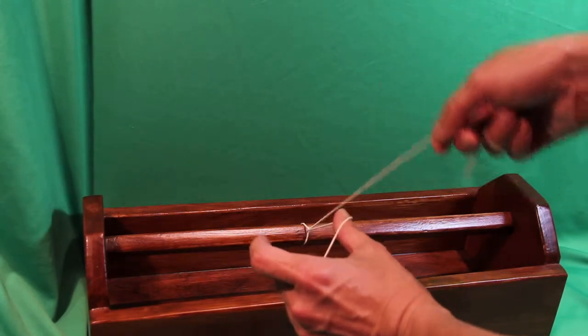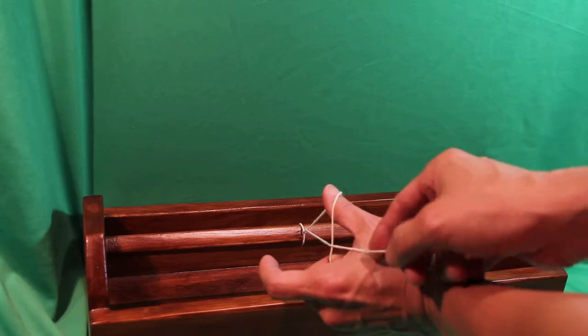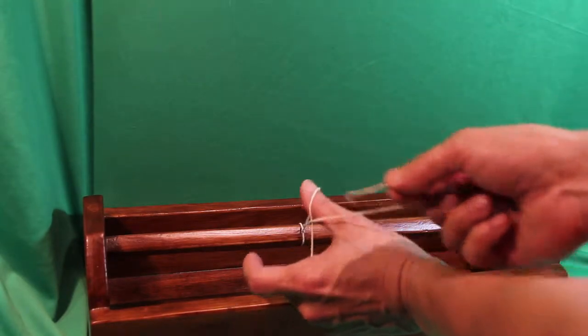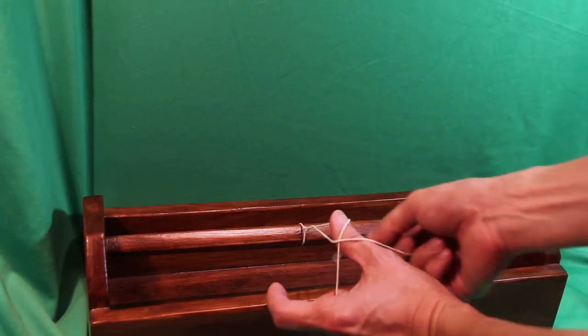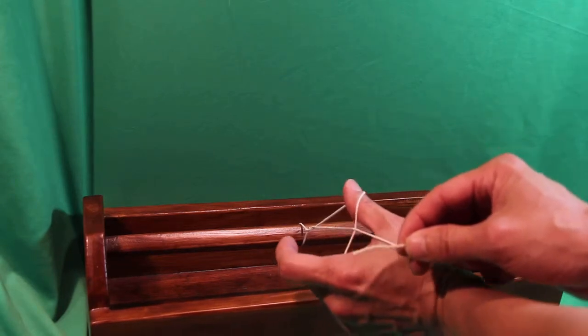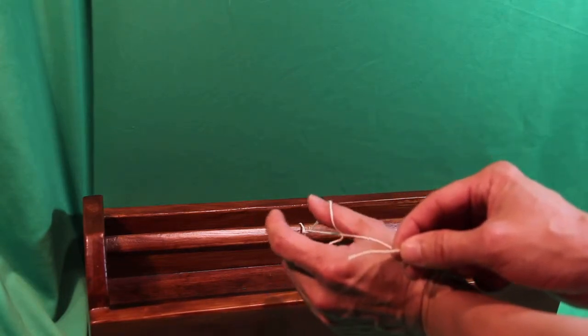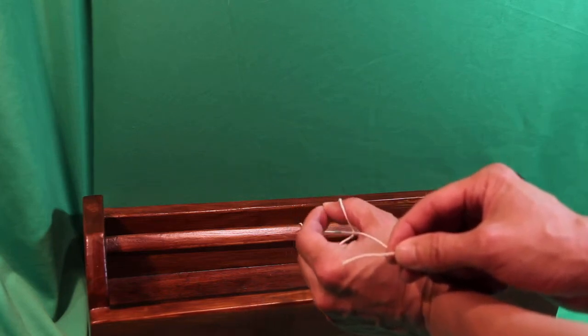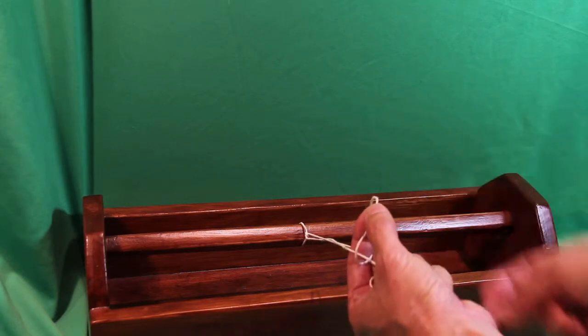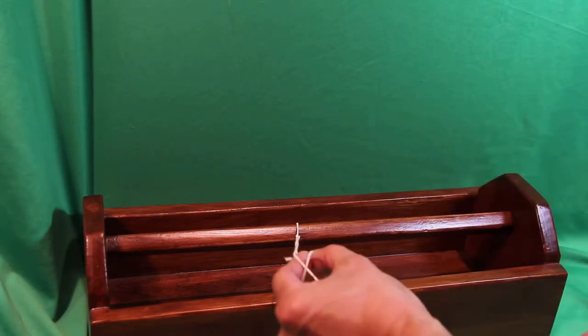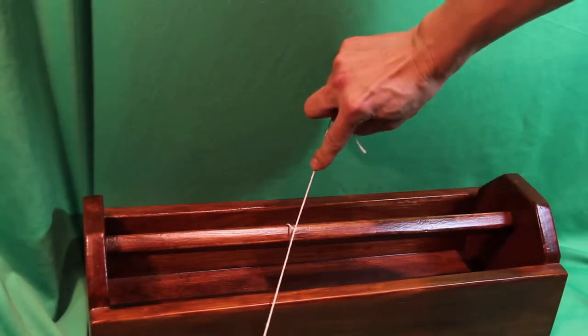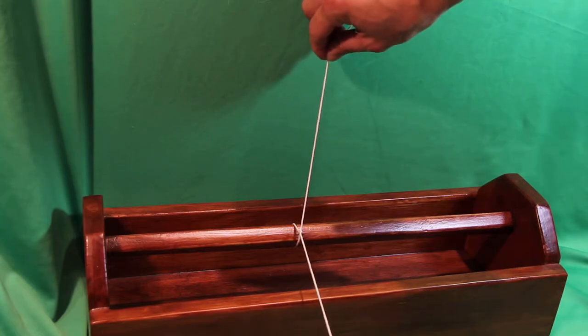This strand now, instead of going under, you go over to create a cross. So your goal is to get this suture around this loop. So you can do it this way, but it's very cumbersome. So you have to do it the easy way, the right way, the surgeon's way is to grab, pinch, index and thumb across the loop, hand it off. Hand off the strand, and come back under it. And that completes your square knot.